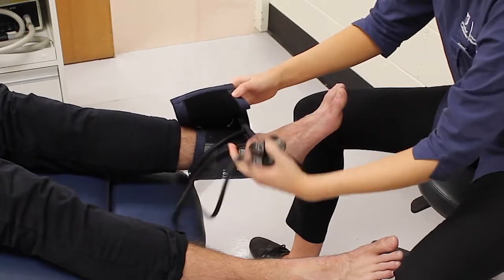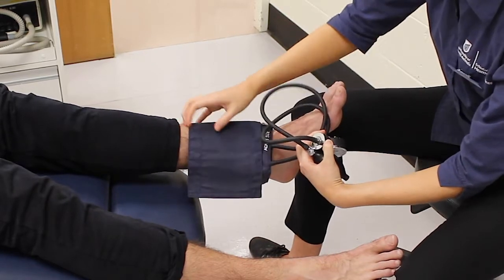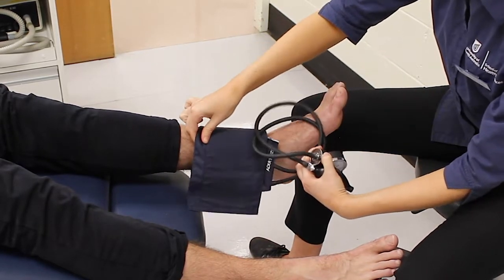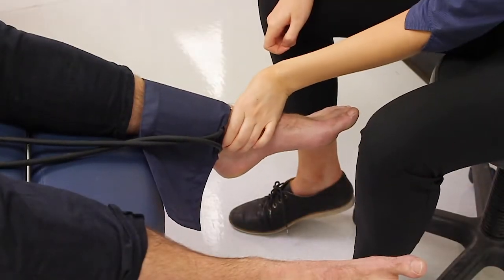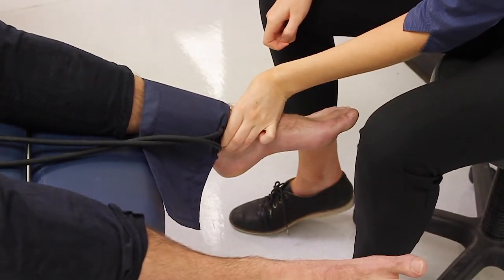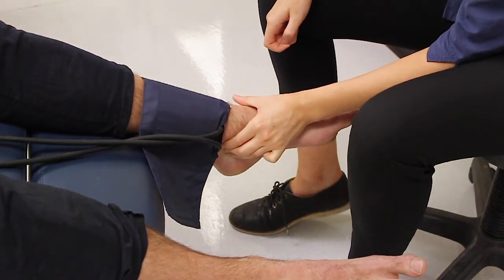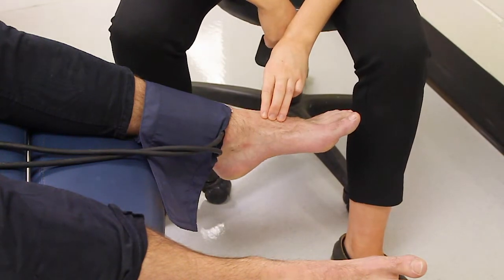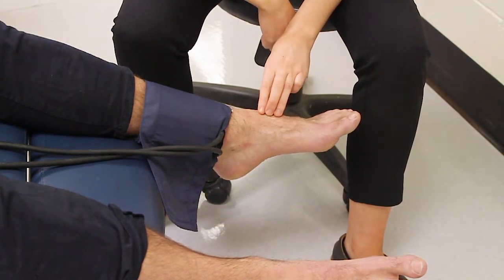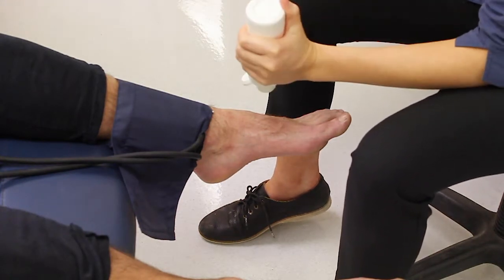Position the blood pressure cuff on the ankle. Using your pointing and middle finger, find both pulses on the feet. Apply ultrasound gel and find the pulse using the Doppler.